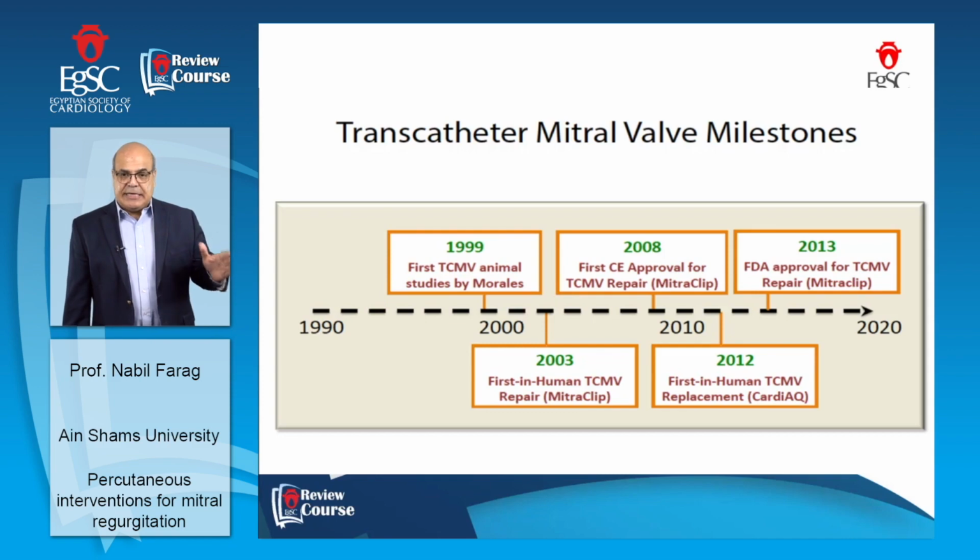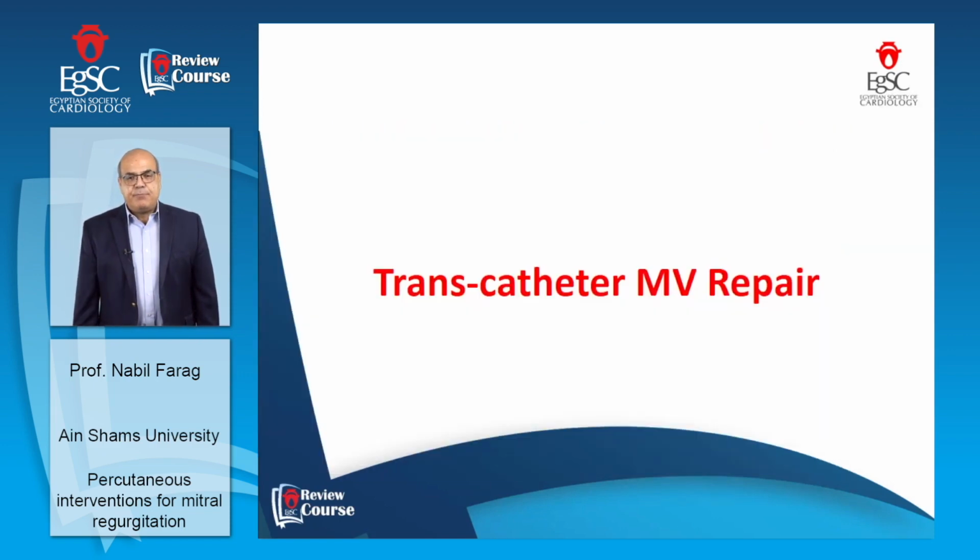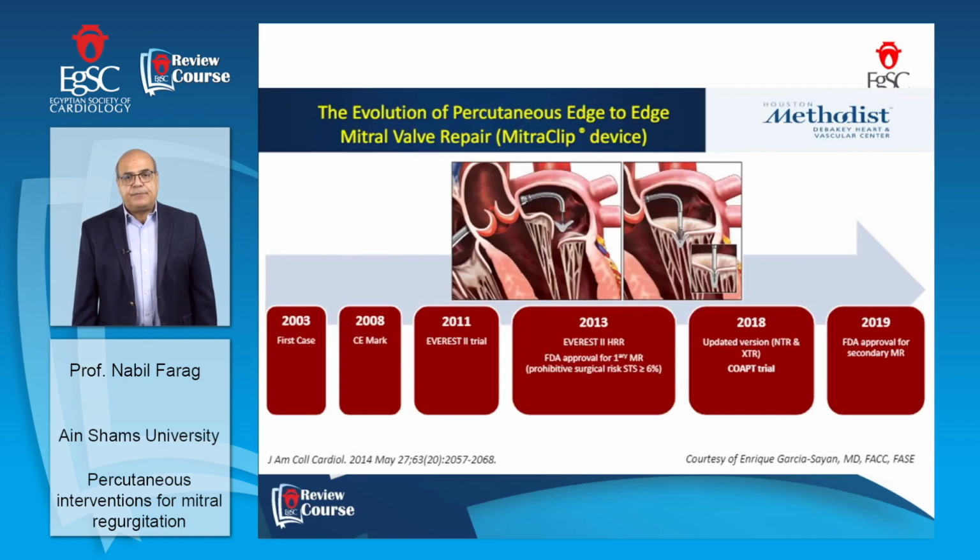So CE in 2008, FDA in 2013 as regard mitral valve repair. Let's go to this very important subject, which is transcatheter mitral valve repair. Transcatheter mitral valve repair is growing, and I think it will be one of the gold standard treatments in patients with severe mitral regurgitation who are prohibitive for surgery or who are considered high-risk patients for surgery. And again, this is the evolution of percutaneous edge-to-edge mitral valve repair.